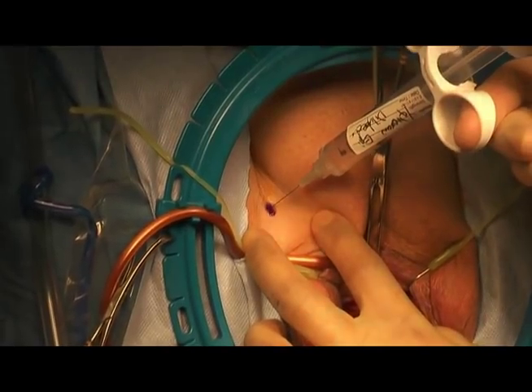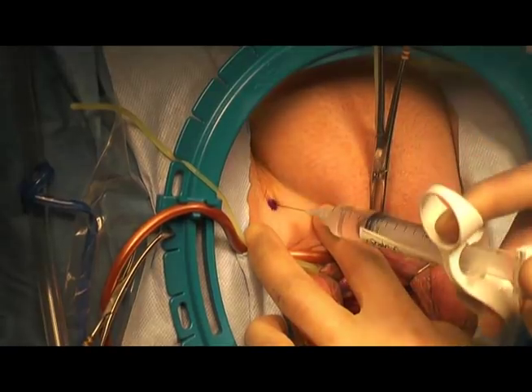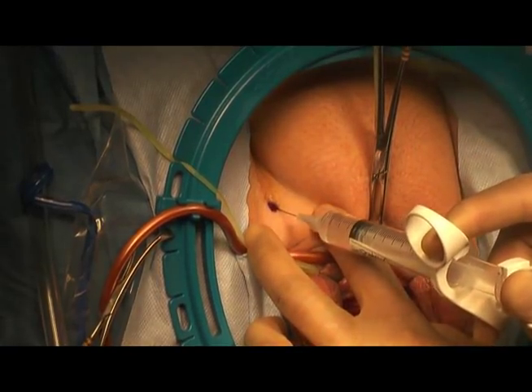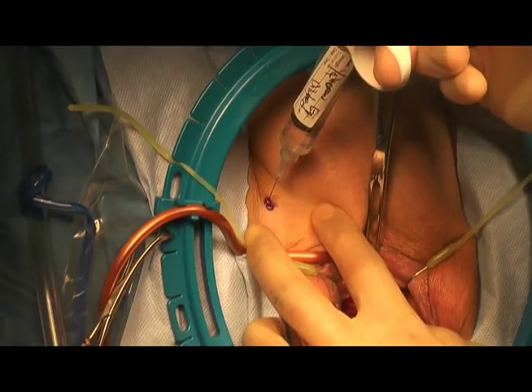I do it straight in, 45 degrees down, and straight down. I can do these procedures in the office if needed under local anesthetic, and certainly when the patient wakes up she will not have any pain because of this.